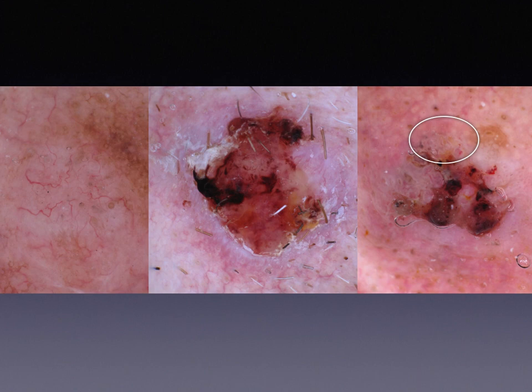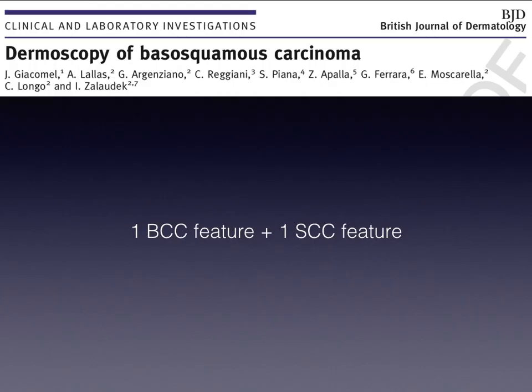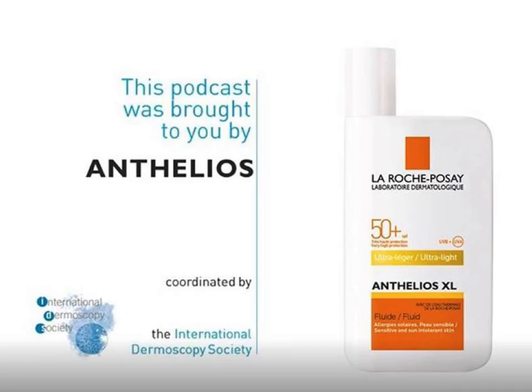In the middle is one more basal squamous carcinoma. We can find SCC clues such as blood in keratin and white circles surrounding follicles in the lower part, but on the upper right we can find linear, arborizing vessels — a clue for basal cell carcinoma. This illustrates the concept that basal squamous carcinoma dermatoscopically displays at least one BCC feature plus at least one SCC feature. Thank you so much for watching this podcast.